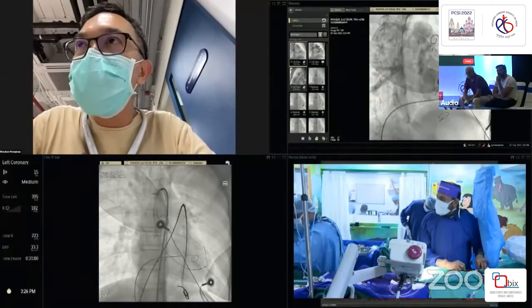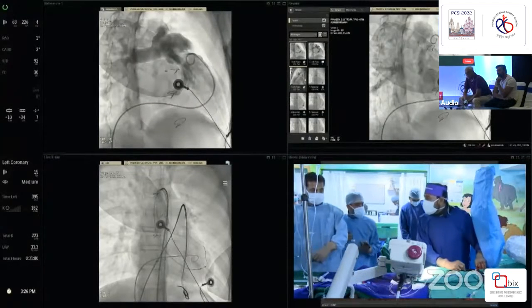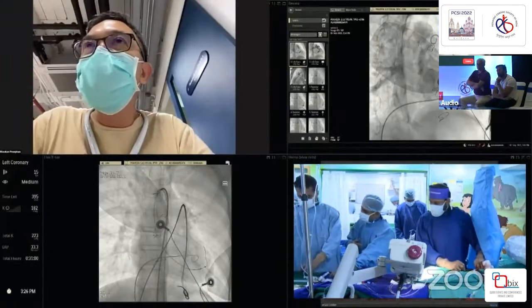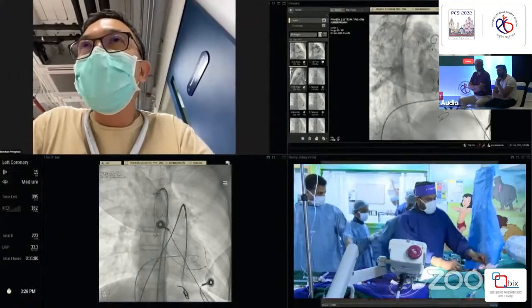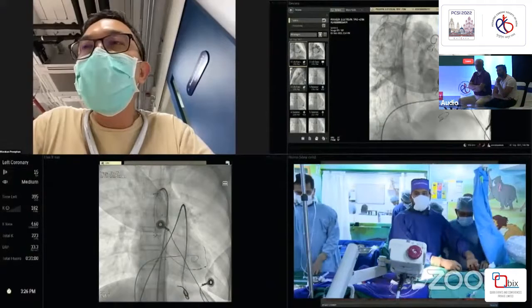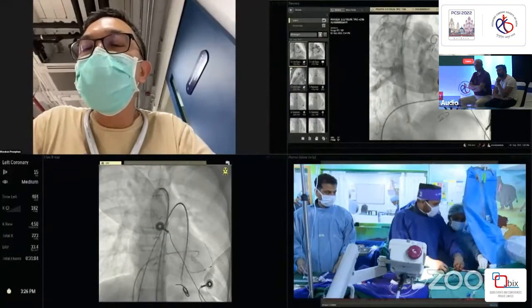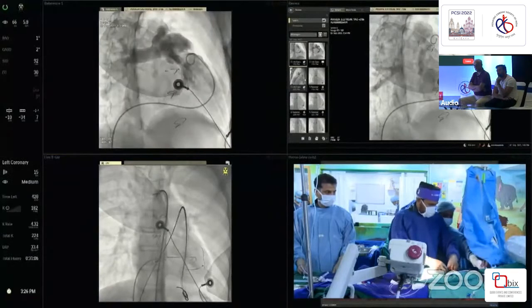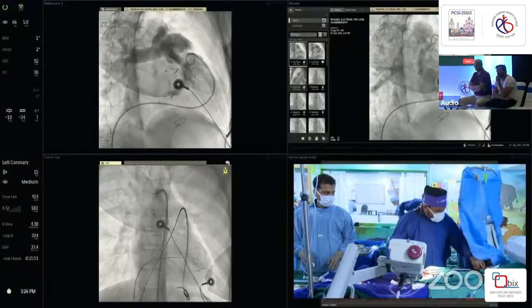So this balloon is 30 millimeter, right? Yes, 30 mm. We are taking the sheath off; that should be okay for 32. Because I think the waist is not moving at all, it's very fixed. So I definitely will rely on that waist to land the valve. I personally will not, but I may choose a 32 millimeter valve, as we plan to do with my valve.